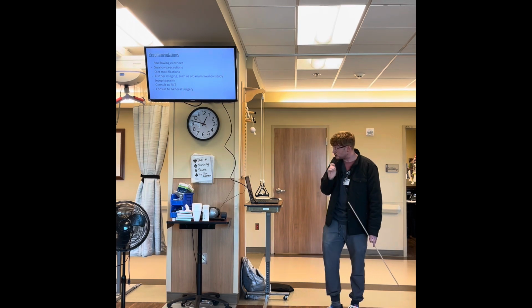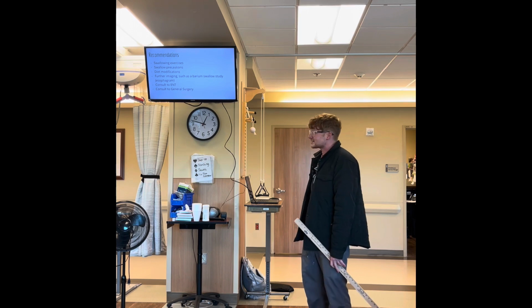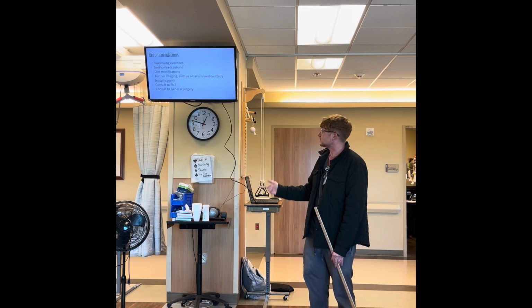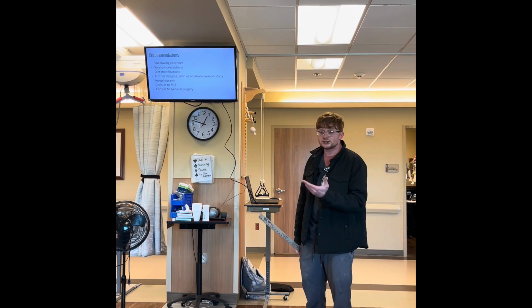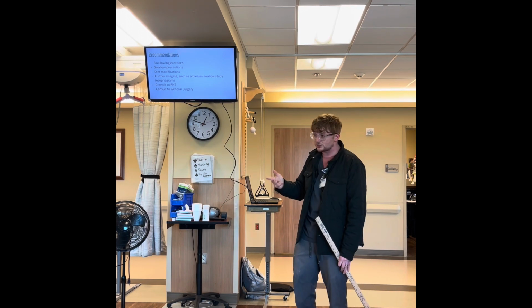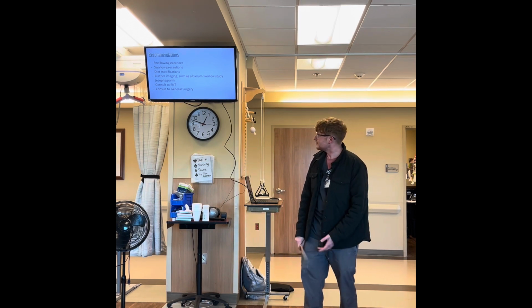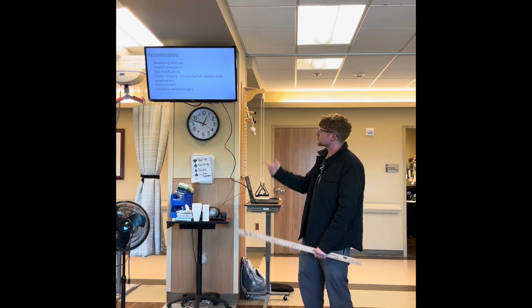Then that's when we can get into recommendations, depending on what we see. There are swallowing exercises, like I mentioned. Sometimes it can be corrected with just precautions. Upright positioning, small bites and sips. The chin tuck adds an extra layer of protection. Diet modifications, if required. If we have to thicken the liquids while we do therapy, then that could be a temporary fix while we strengthen those muscles. Sometimes we need further imaging.